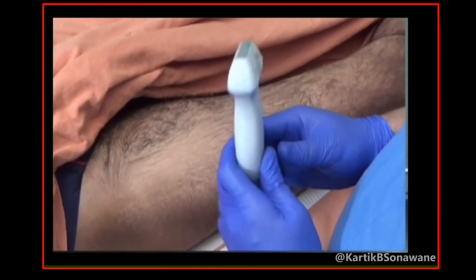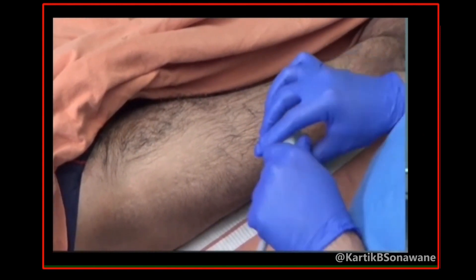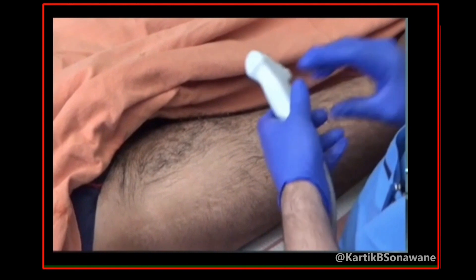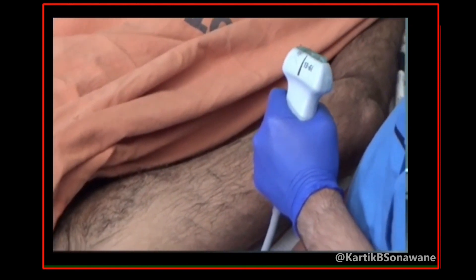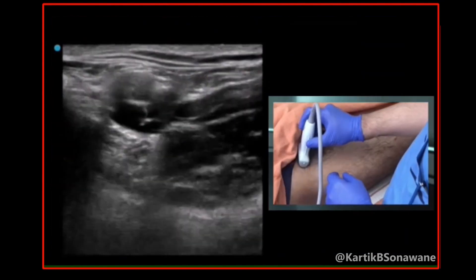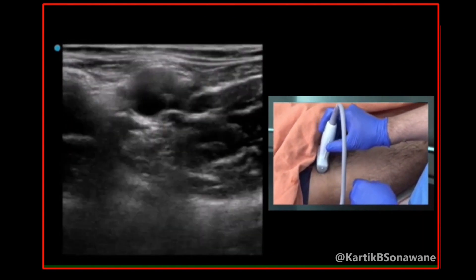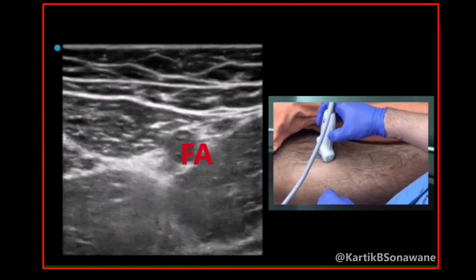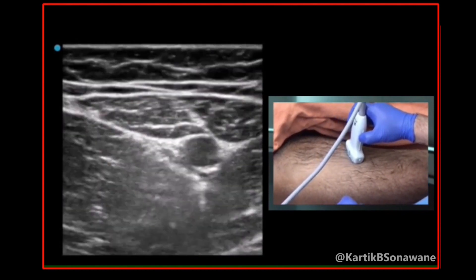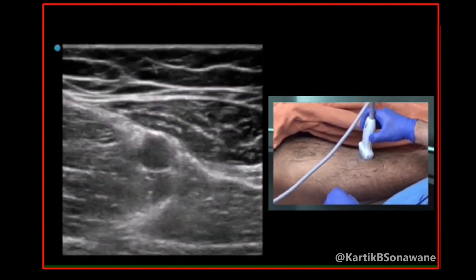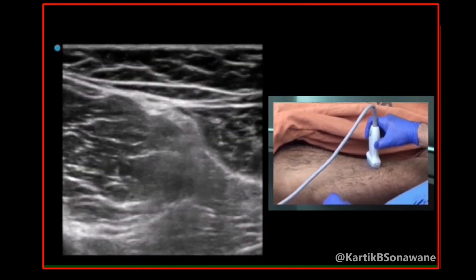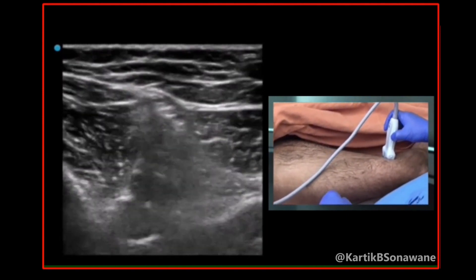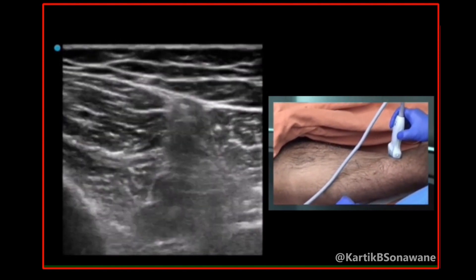For all the blocks at the level of the thigh, usually only a higher frequency linear probe can be used. First we'll try to scan from the femoral triangle area up to the adductor canal area. The femoral triangle can start from the inguinal crease, so we will just trace the vascular structure first and then identify each muscle. Right now I am over the inguinal crease, tracing the femoral artery like a routine femoral nerve block. I can see some variations in the muscles around the femoral artery, with the artery still in the picture.